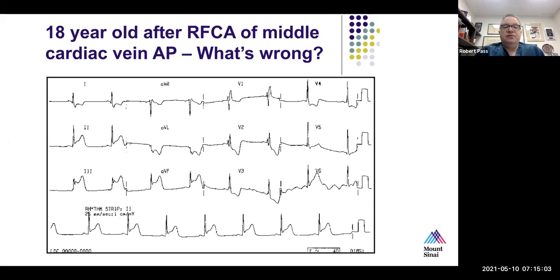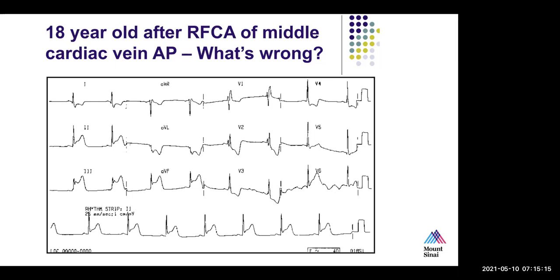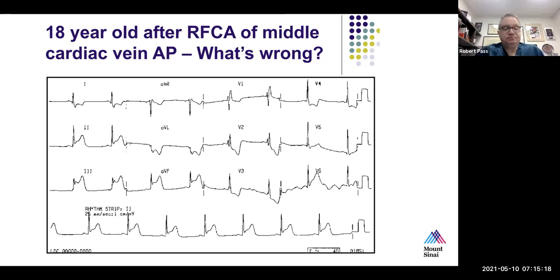So typically, if we were ablating in this region where there's very poor blood flow, the options would be either to use cryoenergy, which does not depend upon the flow characteristics in the ventricle or in the atrium in terms of delivery of cryoenergy. So you can deliver the same cryoenergy in an area with good flow or bad flow. Or alternatively, you could use an irrigated catheter, as Dr. Love often does in many of his ablations. And in that case, you are providing the irrigation yourself, so you're cooling the tip of the catheter with the irrigant, which allows you to deliver more power.